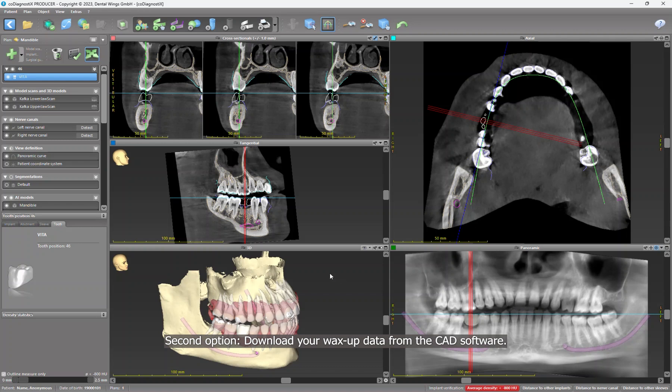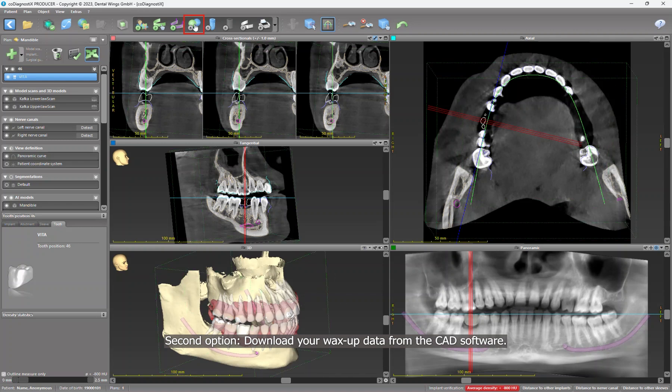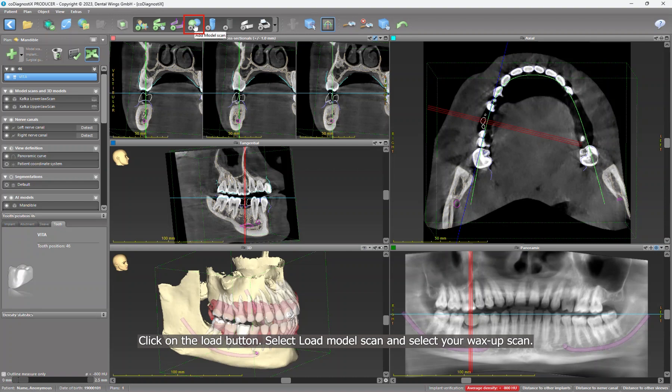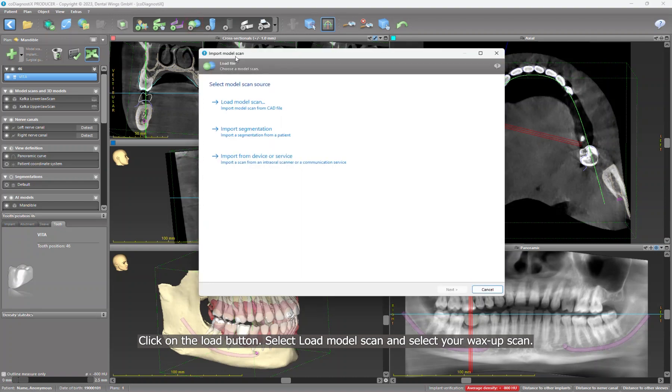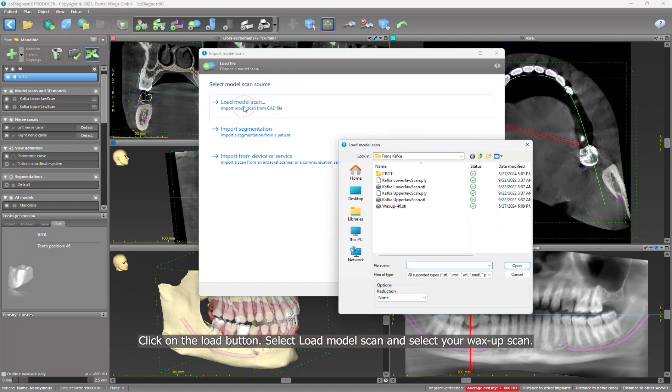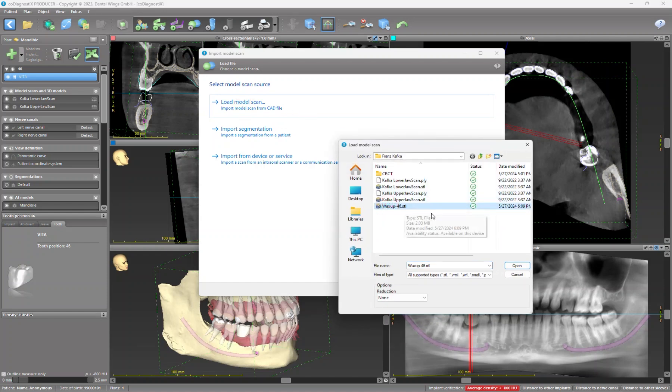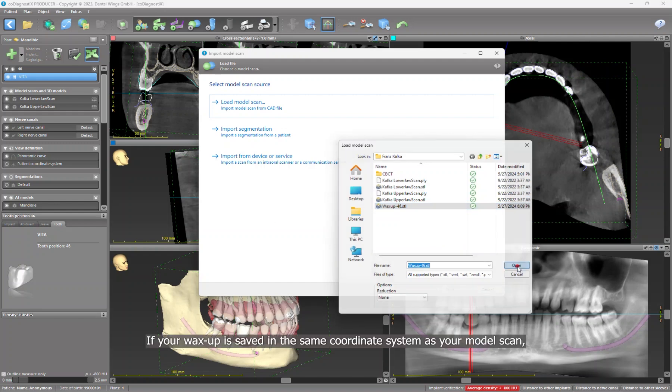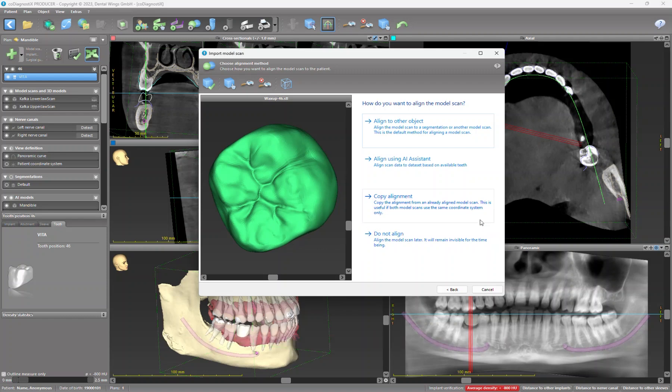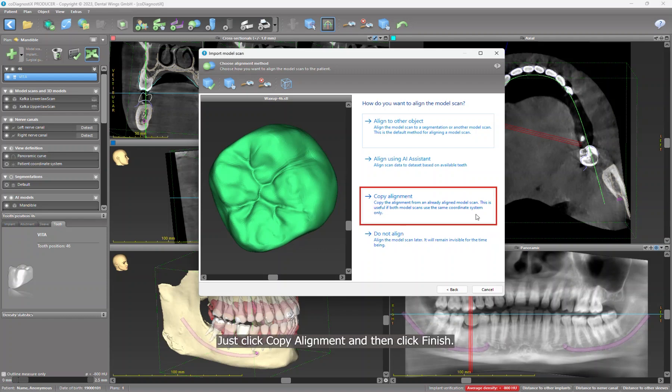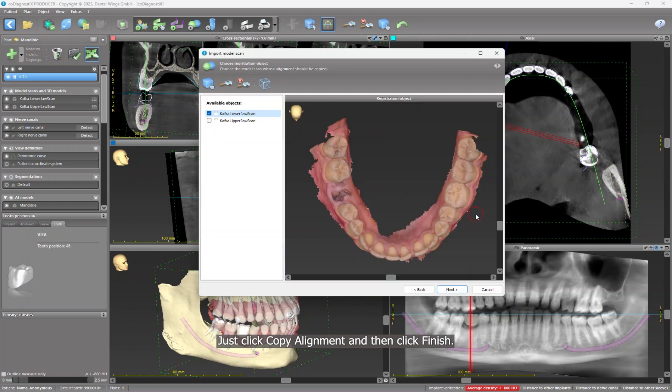Second option: download your wax-up data from the CAD software by clicking on the Load button. Select Load Model Scan and select your wax-up scan. If your wax-up is saved in the same coordinate system as your model scan, it is easy to match it. Just click Copy Alignment and then click Finish.